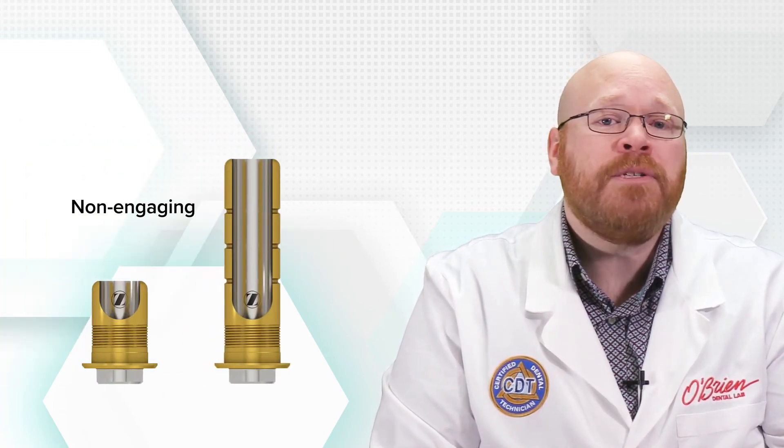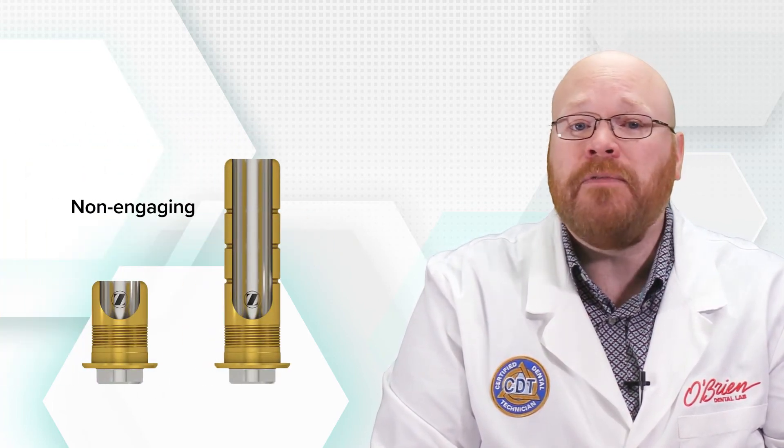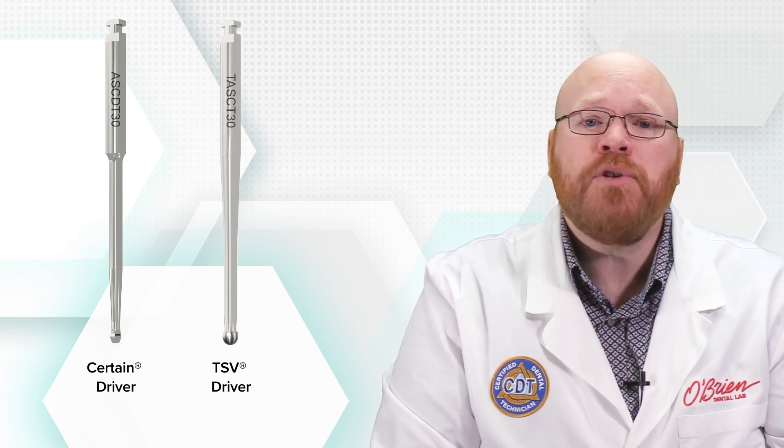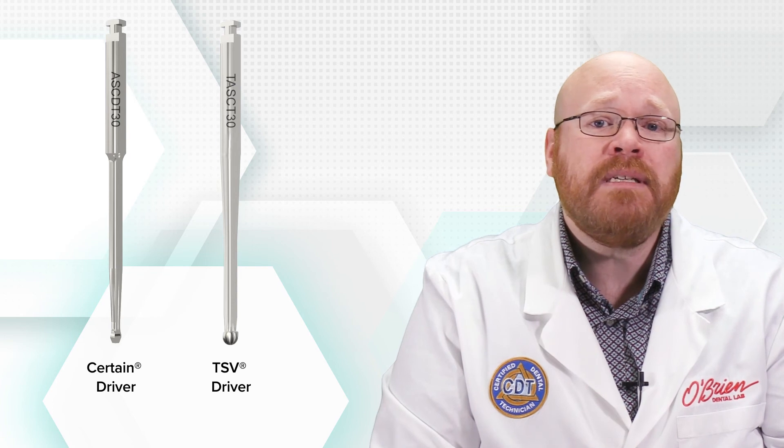Both the Flex and Express abutments are also available with non-engaging interfaces, so they can be used for making splinted restorations as well. As with other angled systems, the Flex and Express do require special drivers to torque. If you're working with both the Certain and TSV systems, you will need a unique driver for each one.